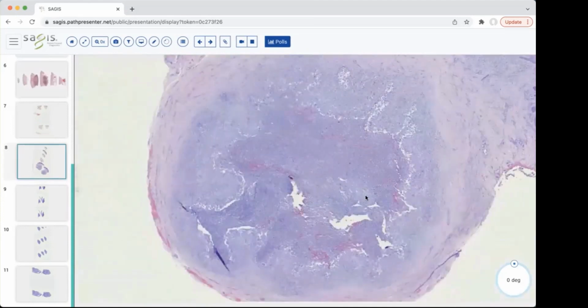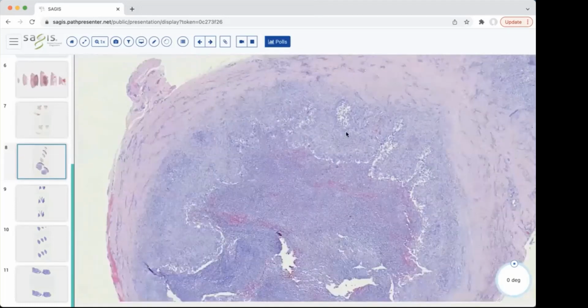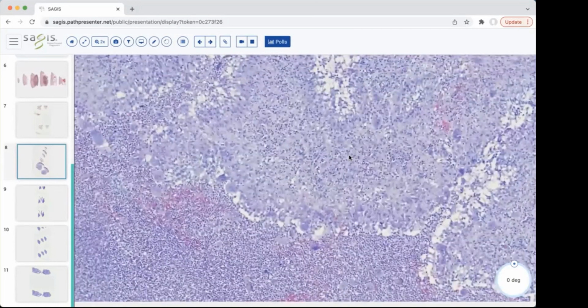Okay. And then taken with that, located in the dermis is this large collection of cells. And I think that you can appreciate there's sort of this lighter staining outer portion, and then maybe a more deeply purple or blue inner portion. So we'll go ahead and look at the lighter cells on the outside. And I'll let that focus in here.